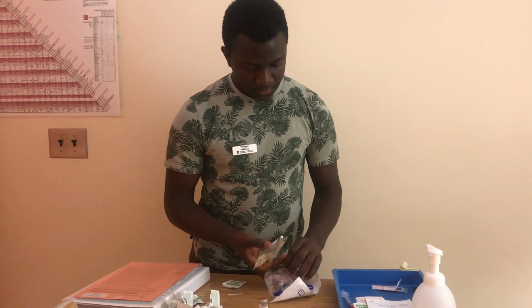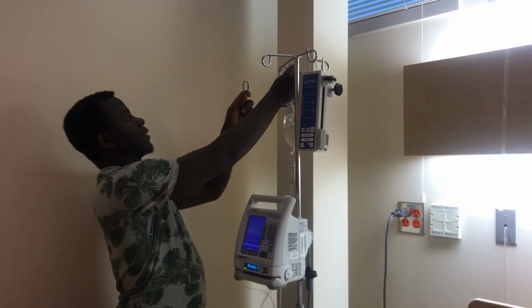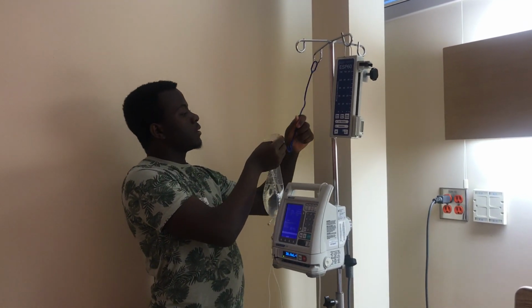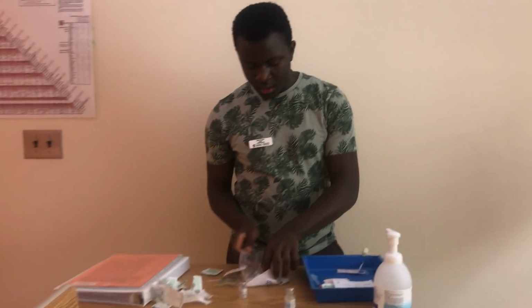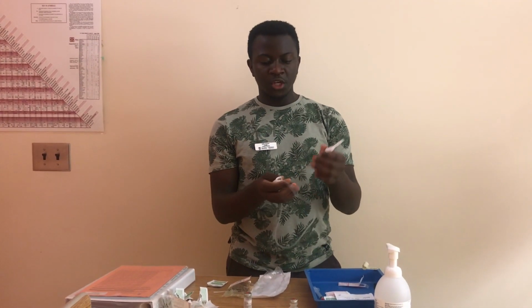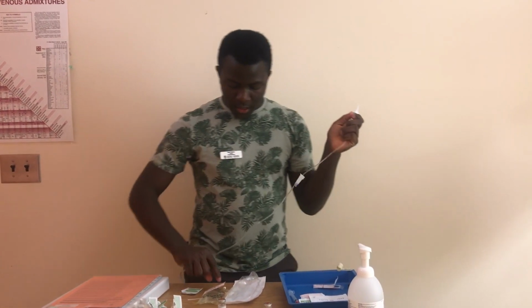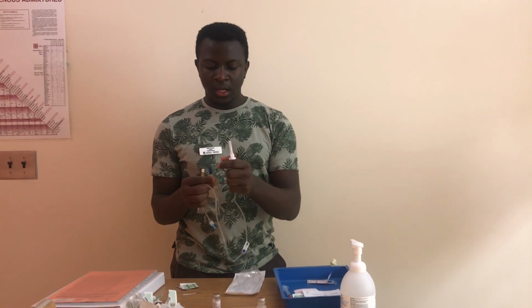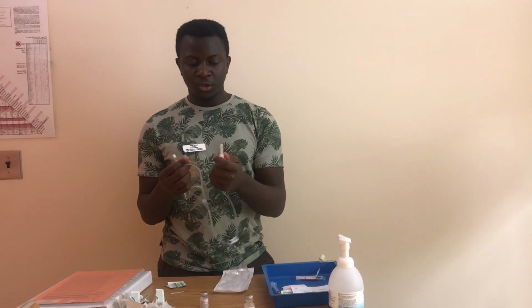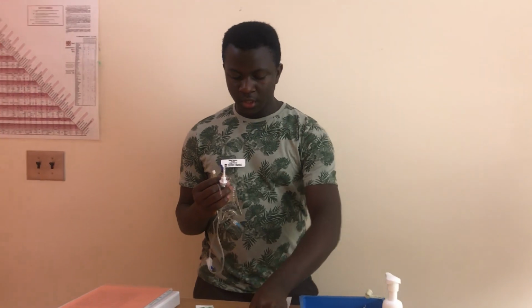So I will then, first I will bring down my primary IV, my primary fluid here. Now close my clamp here to make sure that while back priming, I don't lose any of my medication. Now gently close. I'll gently open my cap here and spike my tubing, making sure I'm maintaining sterility. So once that is open, nothing has to touch it.